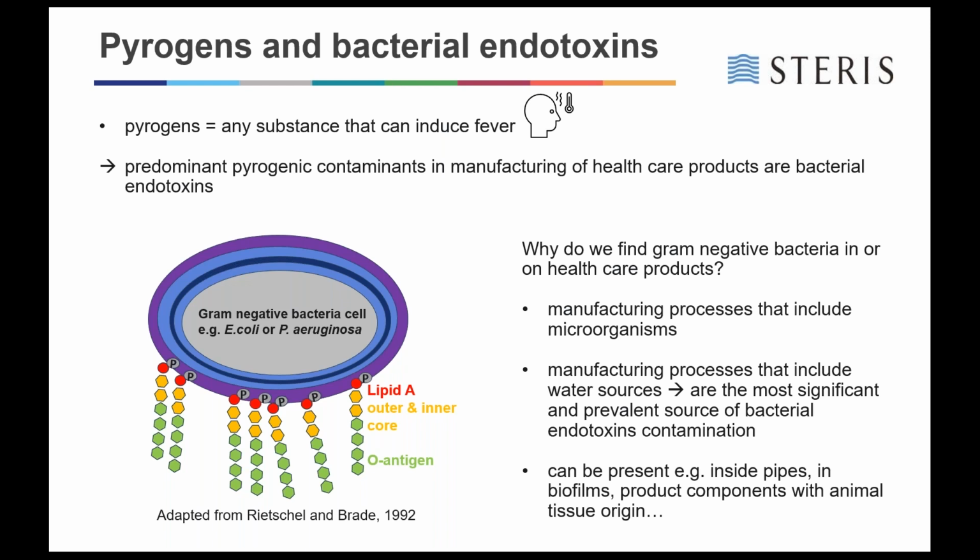In addition, gram-negative bacteria can also be present, for example, inside pipes, in biofilms, or in product components with animal tissue origin.